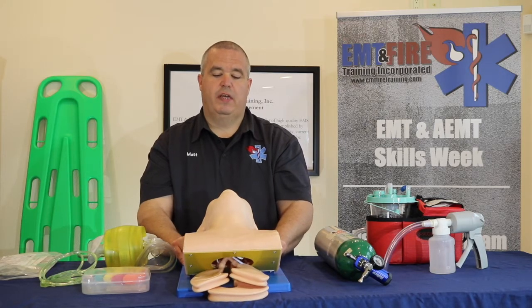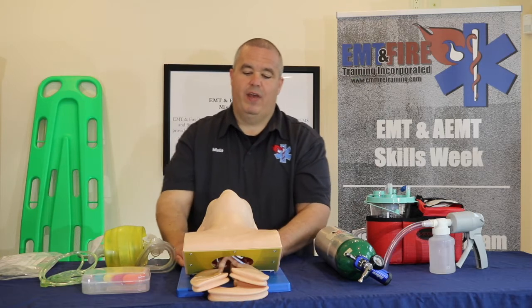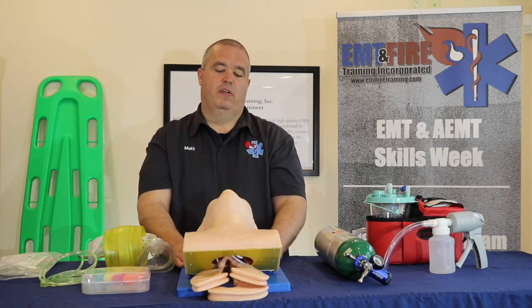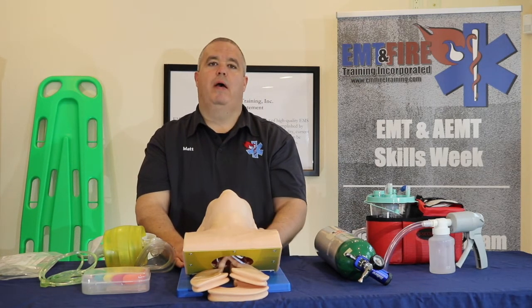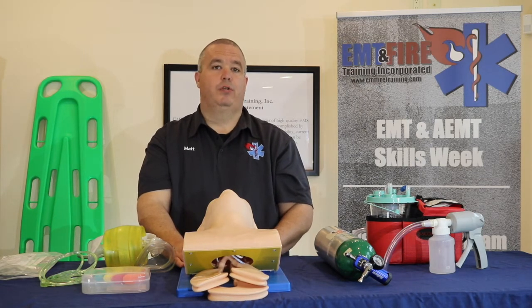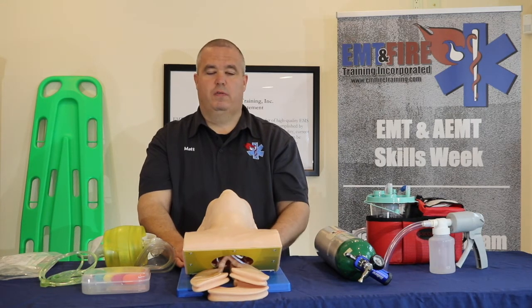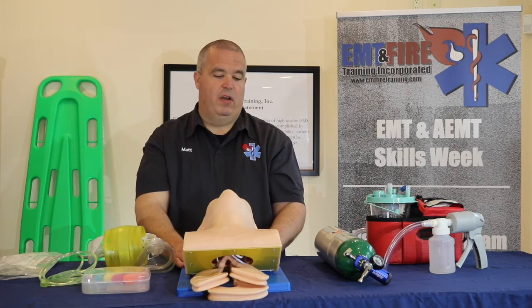Once you open the patient's airway, you want to visually inspect it and remove anything that's not attached. Loose teeth need to come out, saliva, vomit, blood, dirt — whatever's in their mouth needs to come out. Marbles, toys, whatever's in there has to come out.